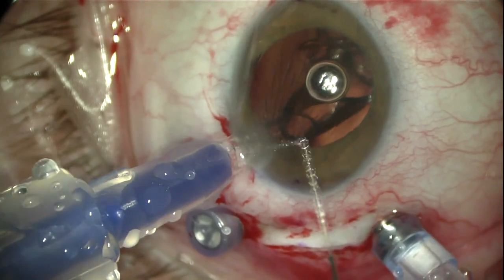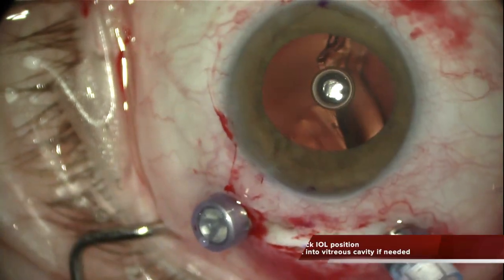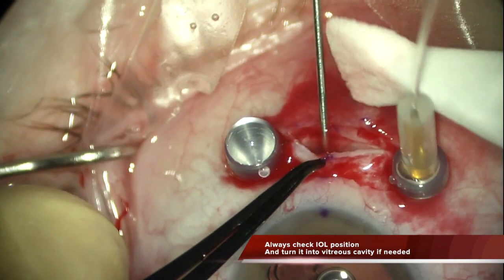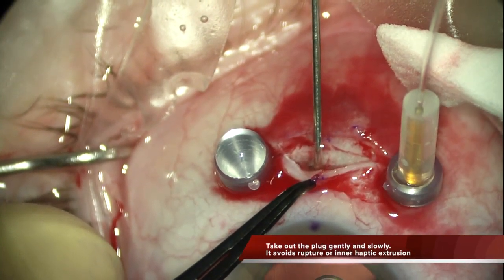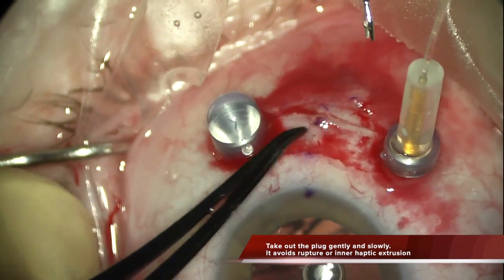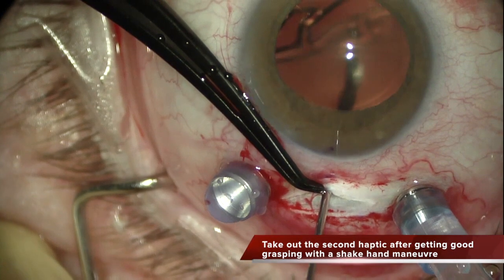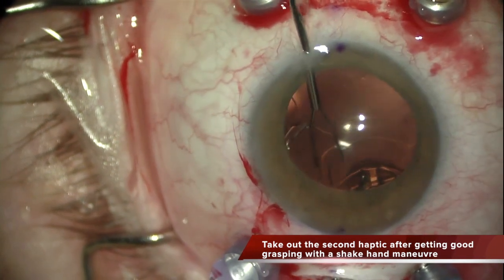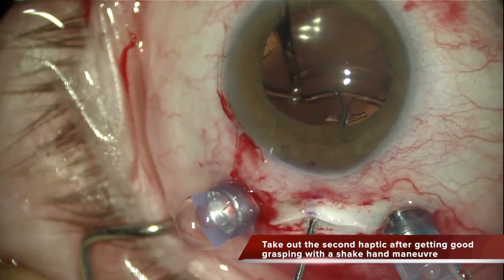Once the IOL is in the vitreous cavity, the position of the lens has to be assessed. If the lens is tangled, you have to untangle it within the vitreous cavity. Once the position is correct, you take out very slowly and very gently the first IOL plug — like in this case, very slowly — in order to avoid taking out the inner optics or breaking the plug. Once it is out, you grasp the plug from the other side, and prior to taking it out with a second-hand maneuver, you make sure that you have a very good grasping of the center of the T-shaped plug.